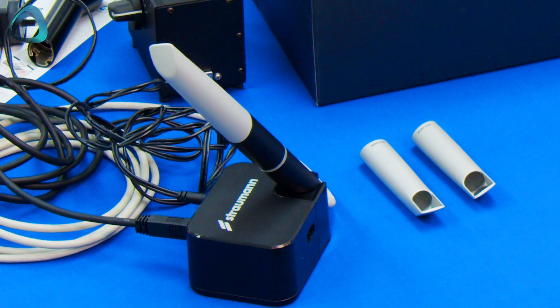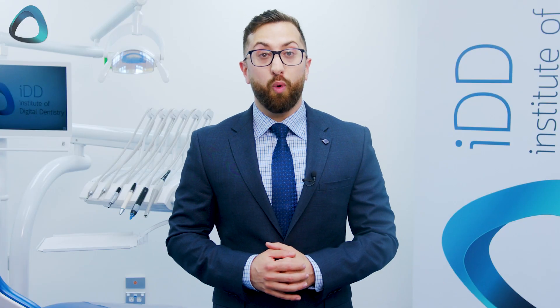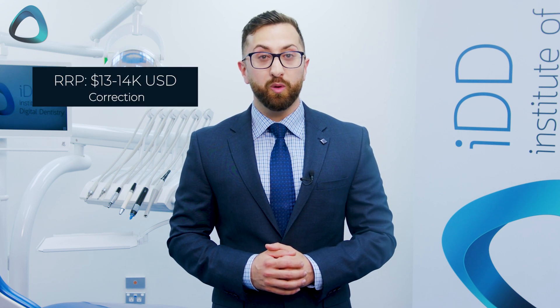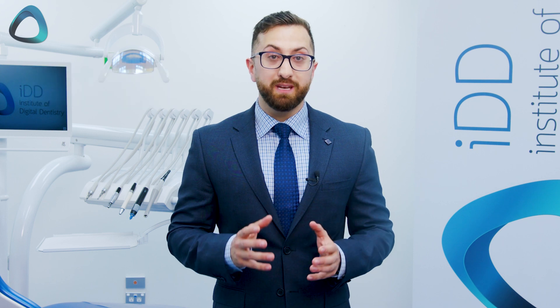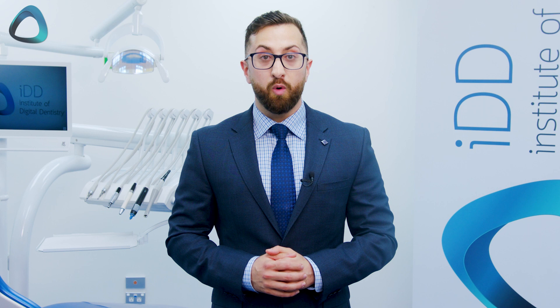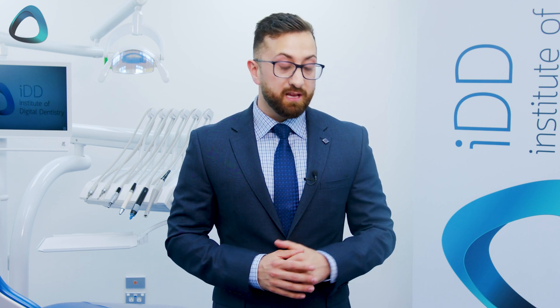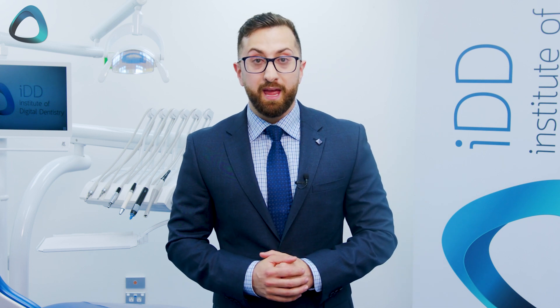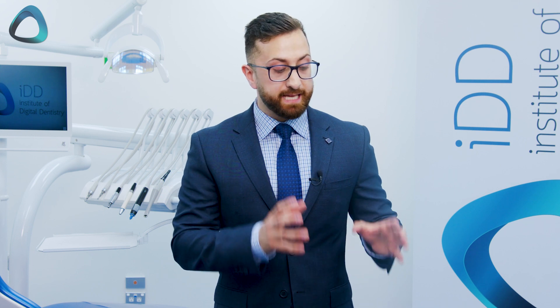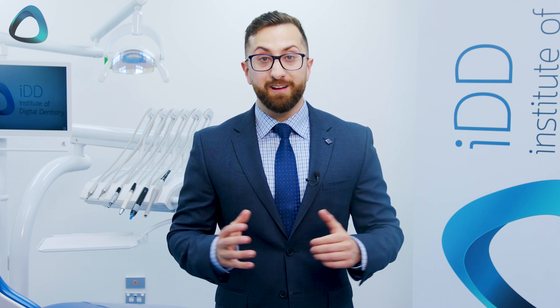And that's basically it for the unboxing of the Virtuo Vivo. As you can see, you get quite a lot for $10,000 to $11,000 USD — it is quite an interesting relaunch of a product. Straumann is really focusing on making this as simple to use as possible while keeping the price tag down. The laptop comes pre-built with the software, and this software cannot be installed on any other computer — it has to be used on the specific laptop provided.